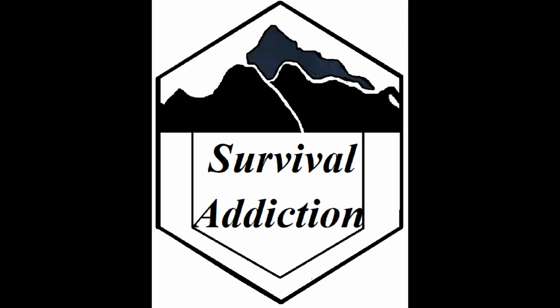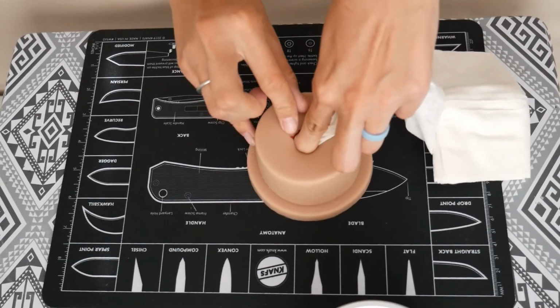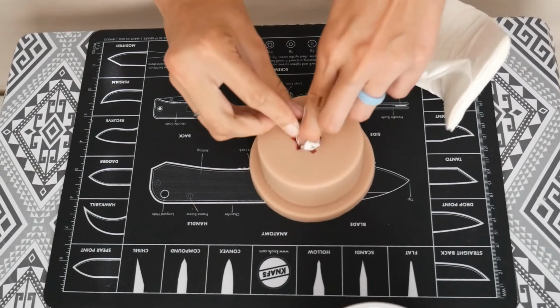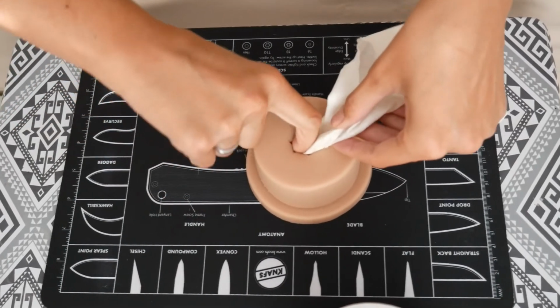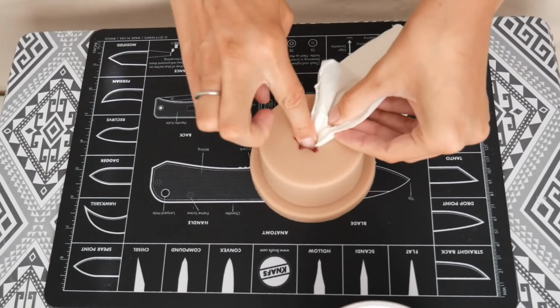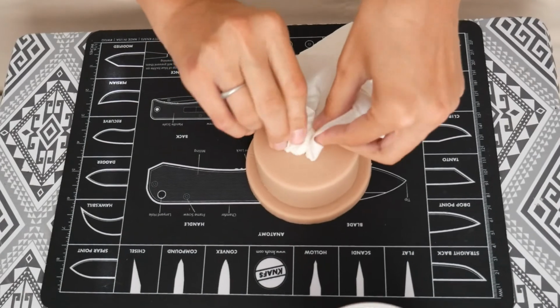And then after those three minutes, you get a roller bandage or a pressure bandage, and you're going to want to just wrap it. And then hopefully get them to a hospital. Hopefully EMS will have arrived by then. But anyways, guys, that is the basic steps for wound packing. These are approved steps by the Committee of Tactical Combat Casualty Care.